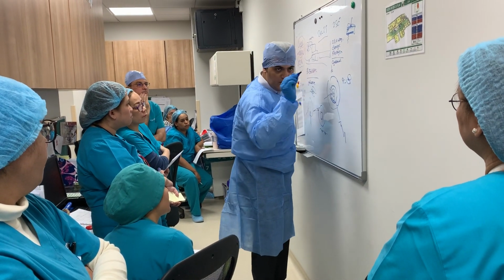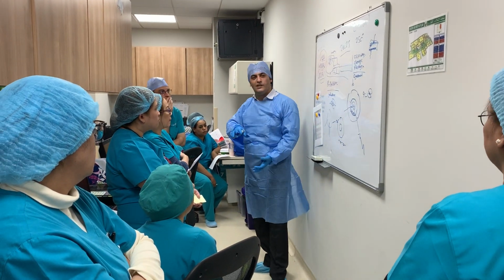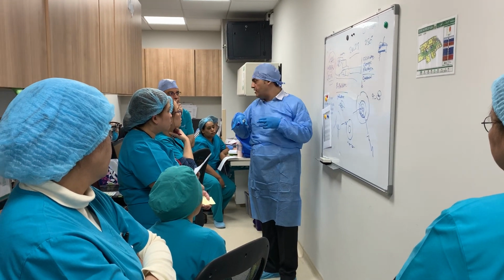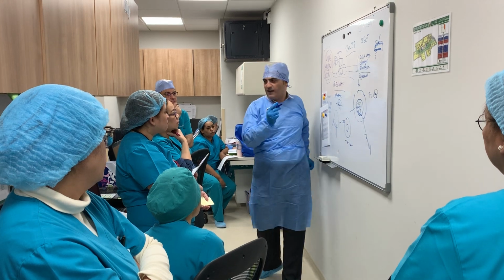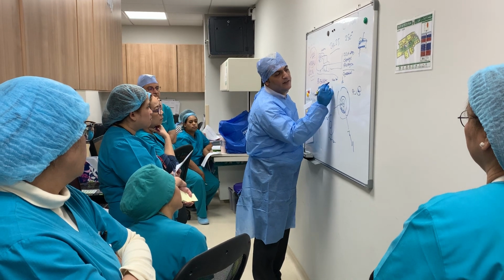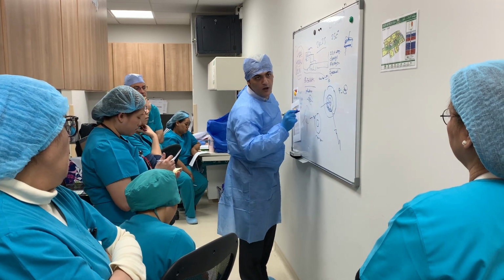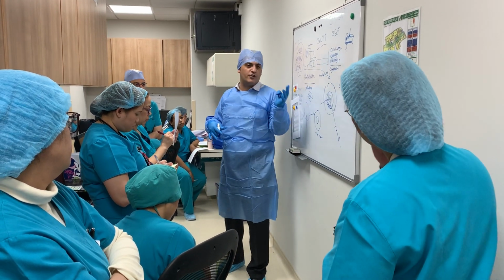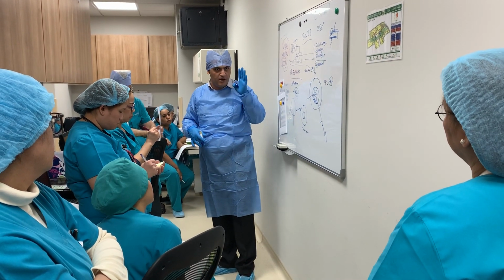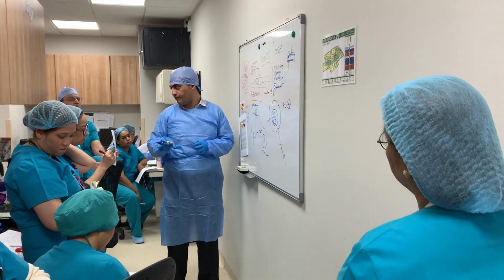We always have a specific concentration per the sperm that we are about to use. If I have a stock solution, like a liter of nanoparticles, I am in control of how much sperm I will be using. In that case, we are using one dose that has 50 microliters, and this 50 microliter volume corresponds to 5 million sperm. Some used to say it corresponds to 10, some 15, but we ended up with the best formula saying 50 corresponds to 5 for the best results possible.